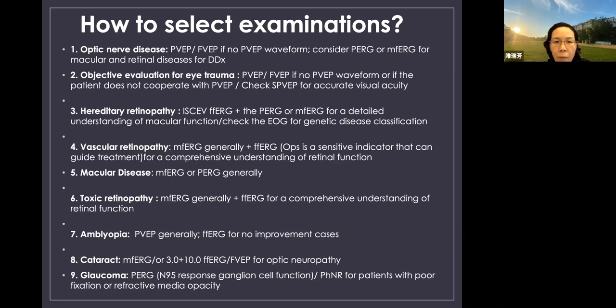for example, only macular involvement like AMD, we will do multifocal ERG. As anti-VEGF is a widely used treatment for vascular retinopathy and also for AMD, we can also use electrophysiology to detect any drug side effect.